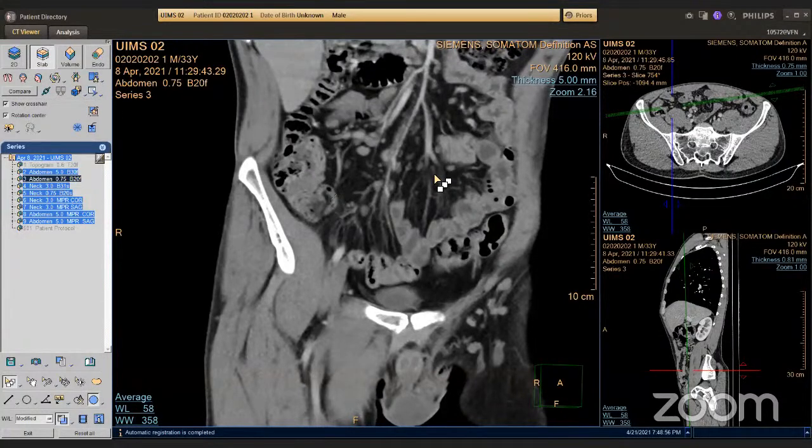It depends. Personally, when I'm measuring lymph nodes, I usually measure the long axis or put two diameters. It depends if I'm doing that for hematologists with lymphomas, because they need it for some tables and so on. So it depends. But usually, yes, you should measure the short axis of lymph nodes. Any other questions?